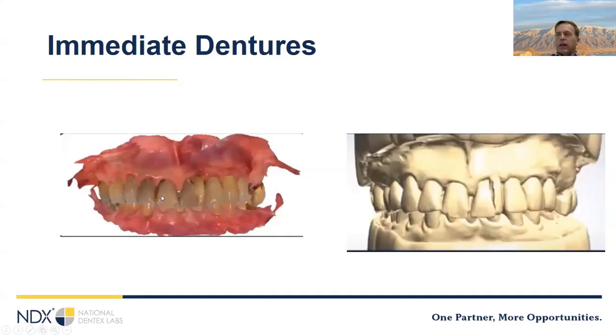And then what's cool is that you can use your immediate denture once the patient's healed to do the reference denture workflow. So you can scan it. And if the tooth position is good, you don't have to do a try-in. You can just do a scan and a finish. So it'll let you do your final in 2 appointments. So that can be kind of cool.